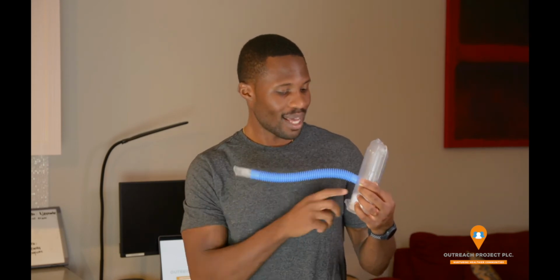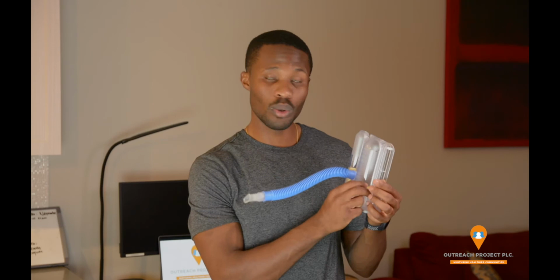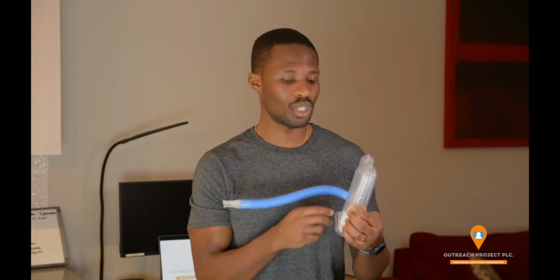So why 1,500 milliliters? At 1,500 milliliters, that's really when we're able to get enough air behind our cough so we can have a very effective cough. If you are underneath that, you might still be able to produce a cough, but if you're noticing the patient is still struggling with airway clearance and really getting mucus out of their lungs, and they're below 1,500, this might be one of the areas that might be lacking and something that can really help them in the long term with airway management.